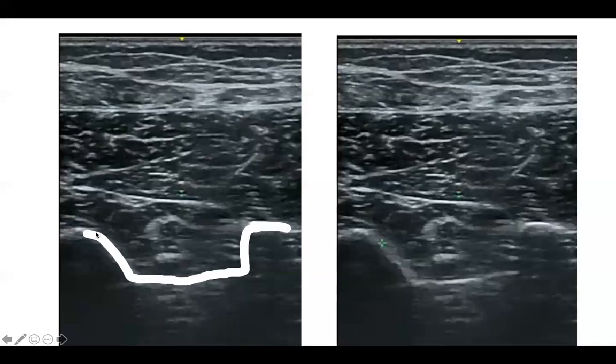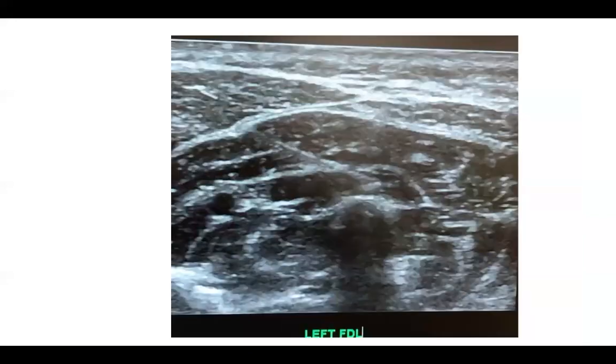So now I am very proud of you guys that you understand the bathtub muscle from the posterior leg. The bathtub muscle is what? Posterior tibialis, when you scan the leg posteriorly. Very good. And I'm gonna go next.